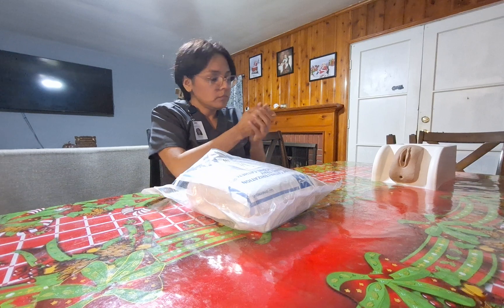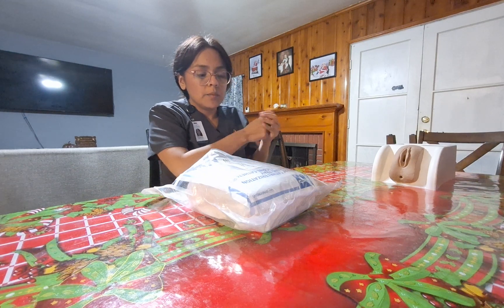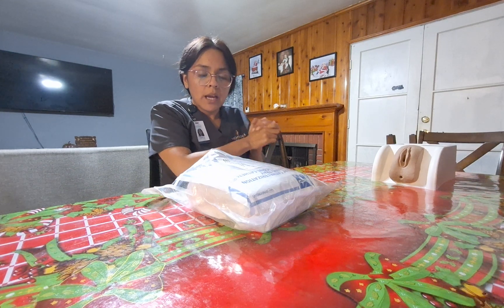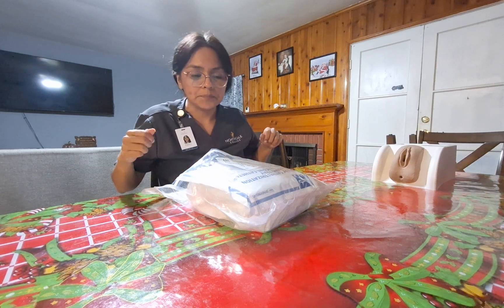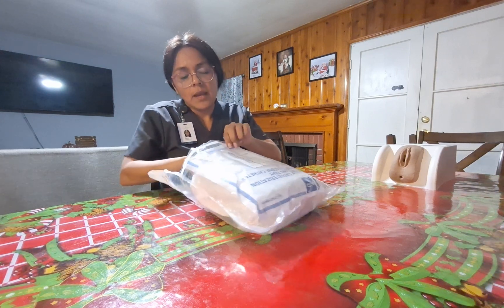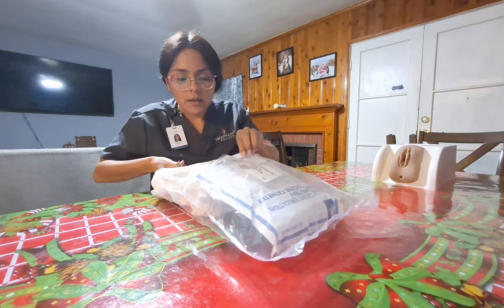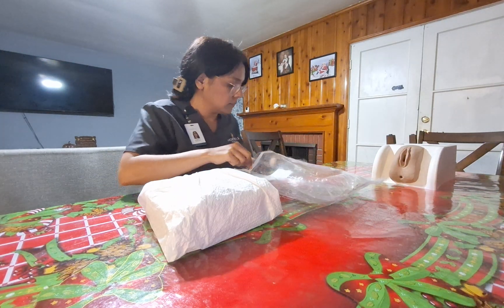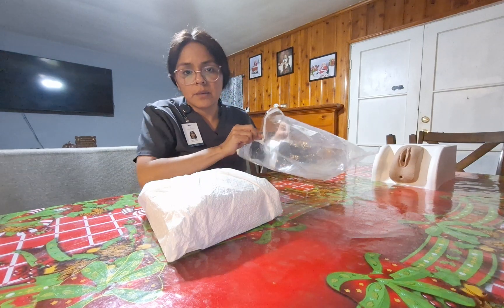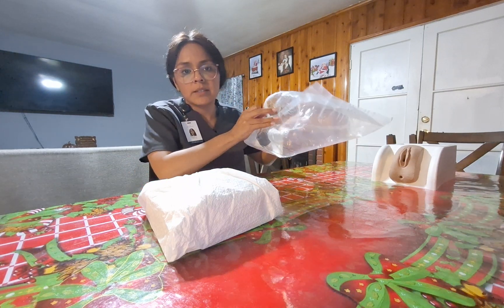I will throw these gloves away and perform hand hygiene. This is a Foley catheter sterile kit and I'm going to follow sterility protocol. I will toss the outer packaging away and use this as a receptacle, saving it here to the side.